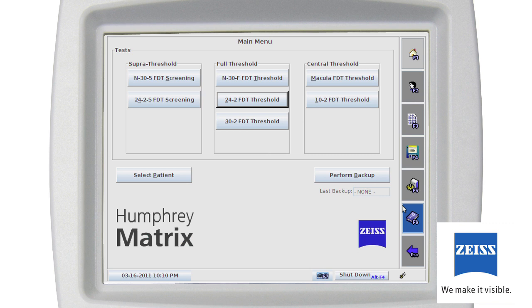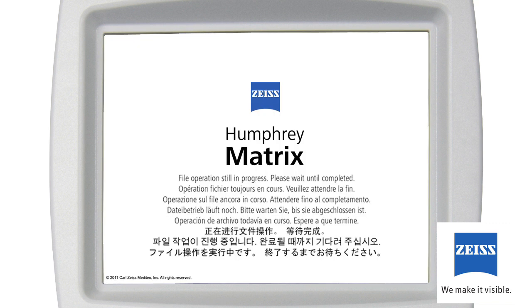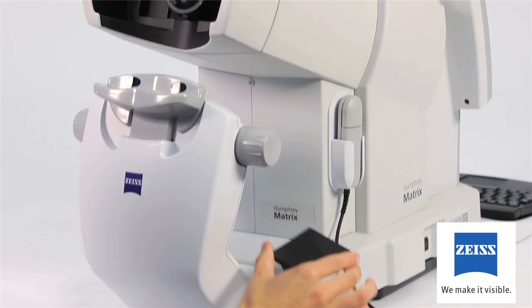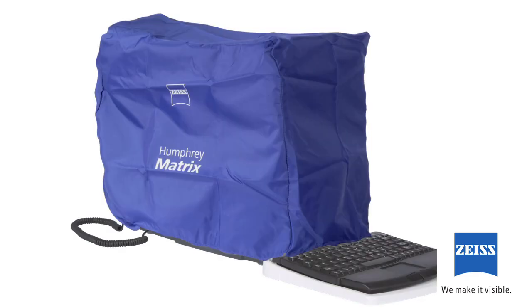Every screen on your Humphrey Matrix has a shutdown button in the lower right corner. Always click the shutdown button and wait for the shutdown to complete before turning off the instrument power switch. After you click the shutdown button, the screen will appear showing the shutdown process — wait until you see 'power down' on the screen to turn the power off. There's no need to shut down the instrument unless it's not going to be used for eight hours or more. The instrument automatically goes into standby mode after 15 minutes of inactivity. At the end of the day, put the calibration cap over the patient eyepiece and cover the instrument with the supplied dust cover. Never cover the instrument if the power is still on.